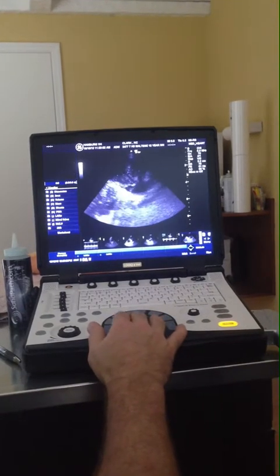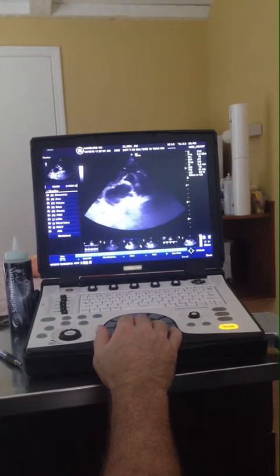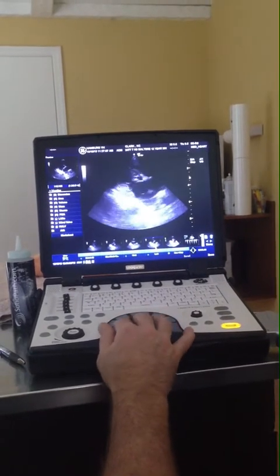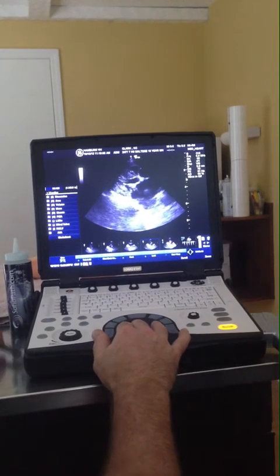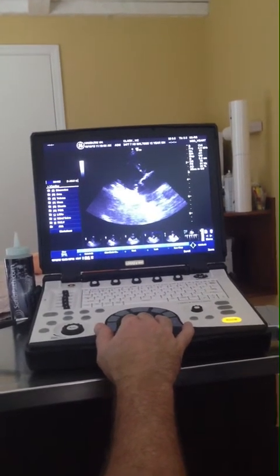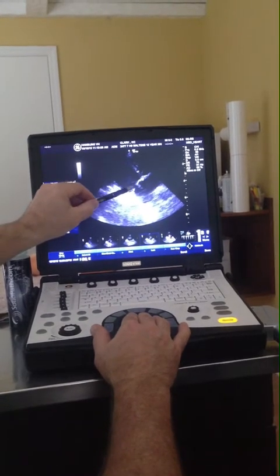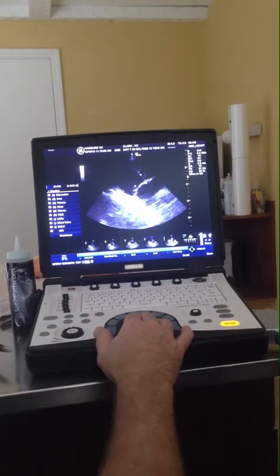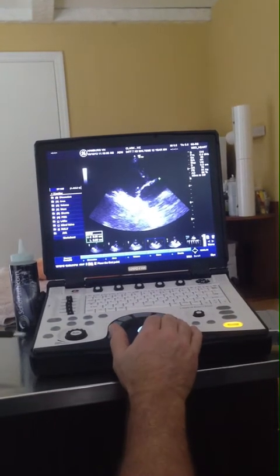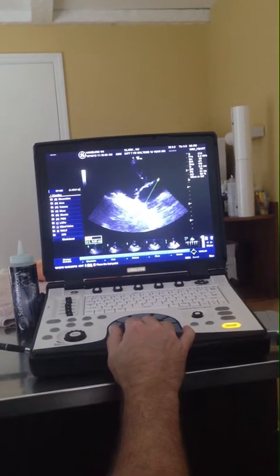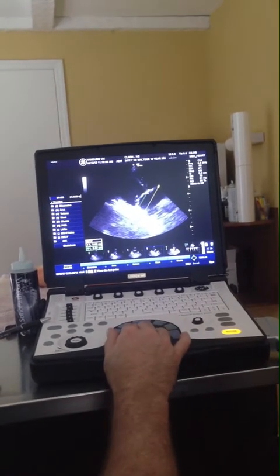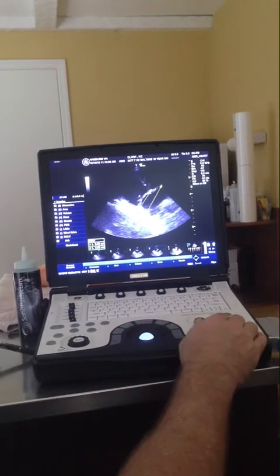Now I'm looking for an LA max position. This looks like a good one — saved. You can see the mitral valve prolapse and ruptured chordae tendineae, with a little appendage visible here. The LA max is taken when the mitral valve is closed, but this mitral valve never fully closes — there's never a complete apposition. That's about as close as it gets. We take a measurement of the left atrium with the atrial septum, internal edge to internal edge, parallel with the mitral valve annulus. Our LA max is 3.62.